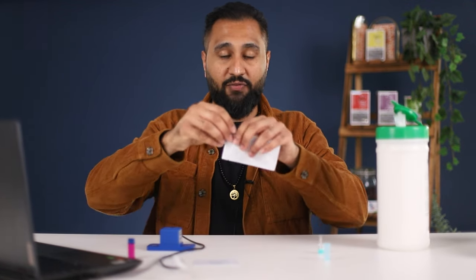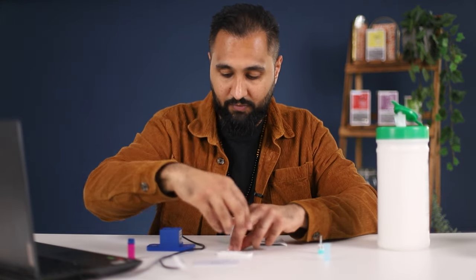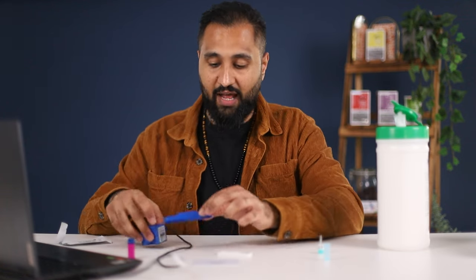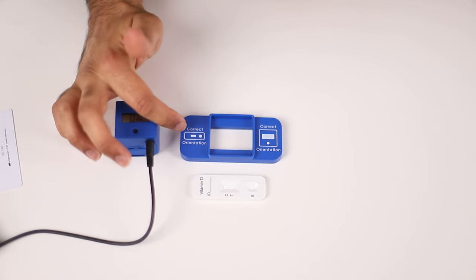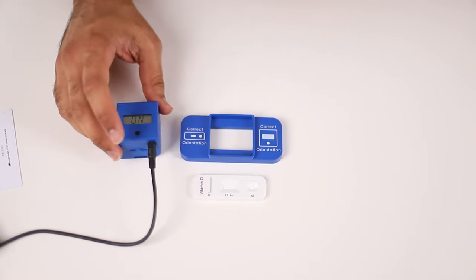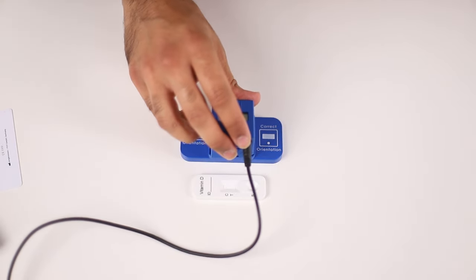To start, I'm going to first remove my test strip from its case. If you look at the cassette it's got the correct shape of where the test strip should be placed. The cassette goes over the test strip when you're performing the test, however for the start of it we're going to leave it completely apart.